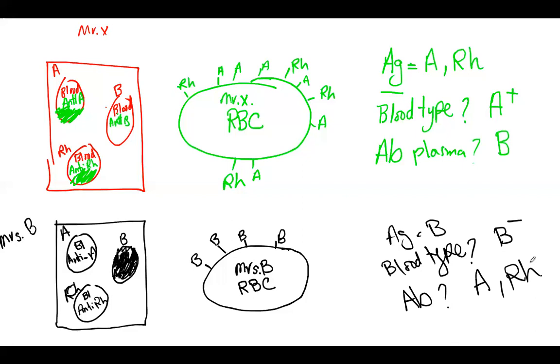Do remember that this is an interaction with a synthetic antibody and not what is actually happening in your body. A lot of people cannot make that distinction because as soon as they hear the word antibody, they automatically think about plasma and how it should not be matching with their antigen. But please do keep in mind that this antibody is not the same as the antibody found in your blood sample.